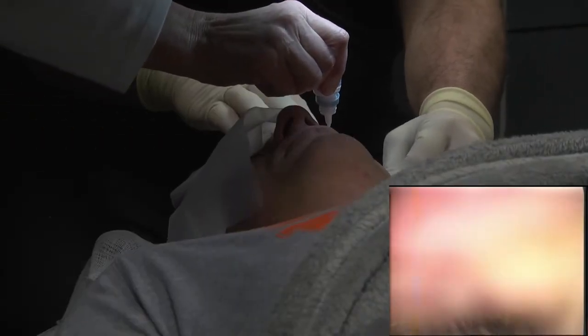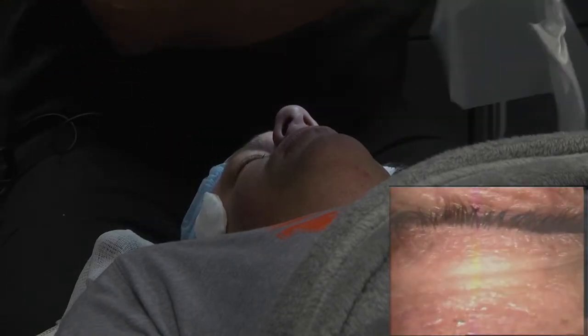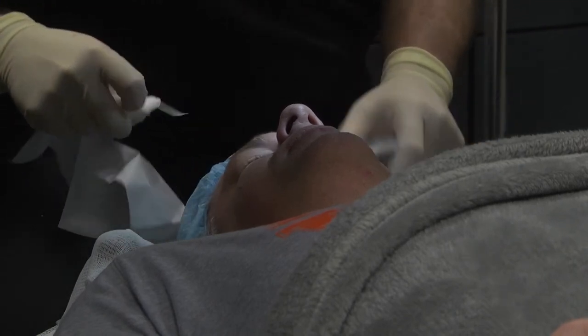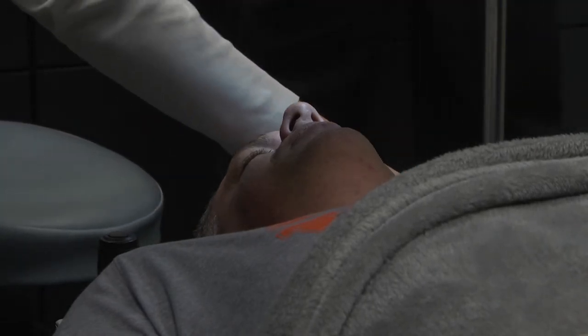I'm just so happy for you. I'm going to take off the little eyelid holder. You can blink all you want. I'm going to dab the drops a little bit. We'll take these off. And you just relax. I'm really, really happy for you. Congratulations.